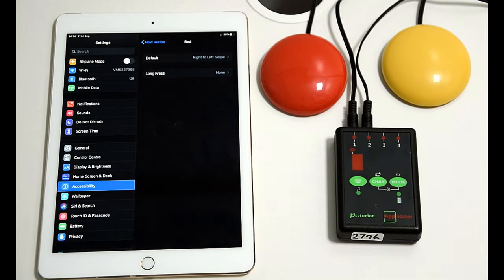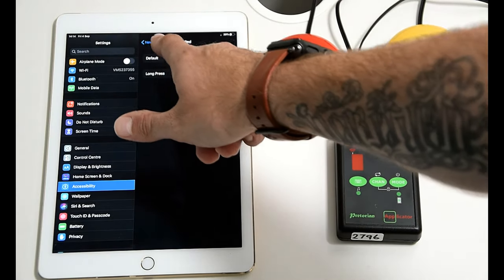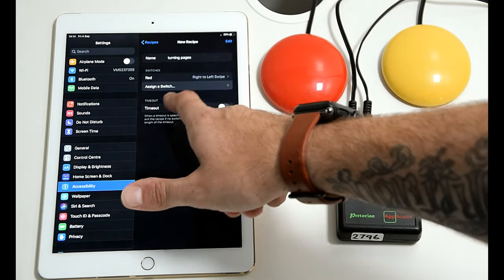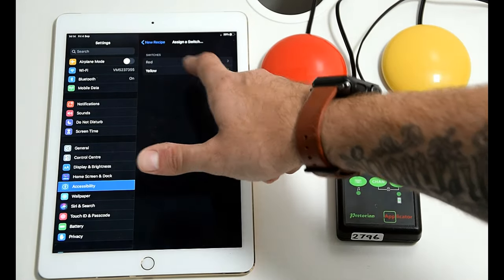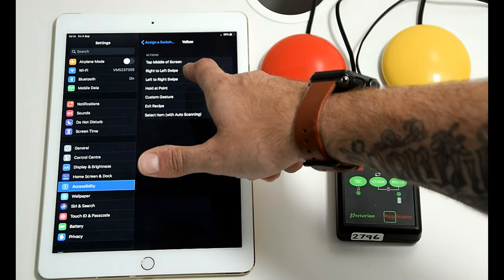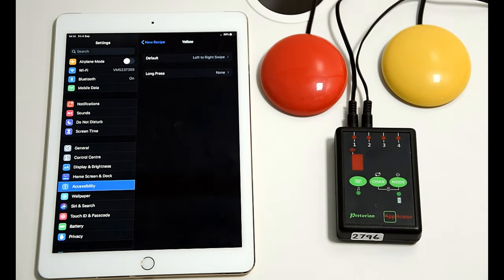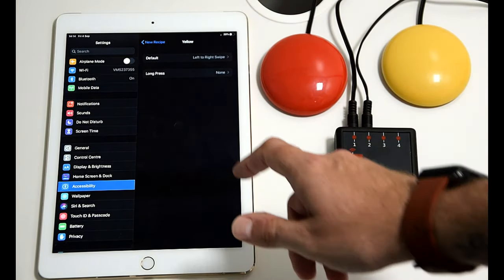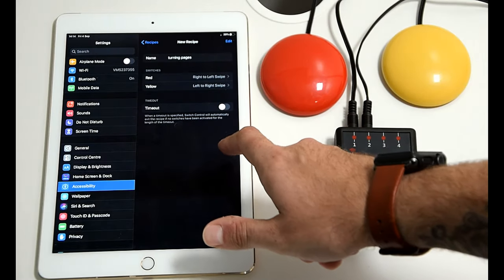However, you can also select custom gestures and make your own as well. So we'll have right to left for red. We'll assign the other switch there, yellow, for left to right to turn the page that way. If we want to go back a page, we'll come back out.